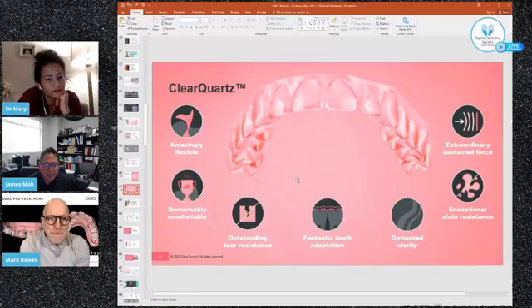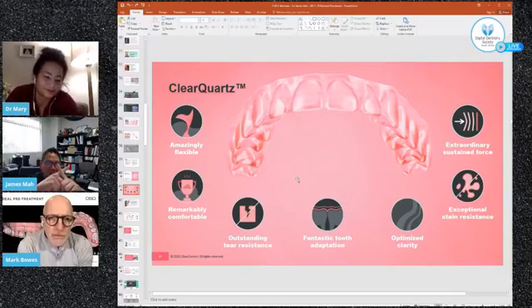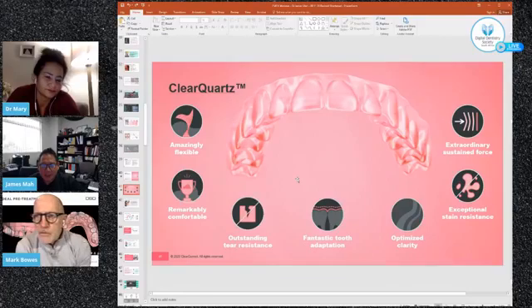This is nice to have, that extra flexibility, particularly for patients that have severe malocclusion or very proclined incisors. I think most of us have seen incisors that are so proclined, you can't get a good path of draw. It's really difficult to seat those aligners because the teeth are maloccluded in opposing directions, right? It's really difficult to get a path of draw, and often we end up cutting the aligner in pieces and so forth to simply get it to seat. But this material is much more flexible, so we'll be able to capture many more of those cases without having to do anything extra like that.